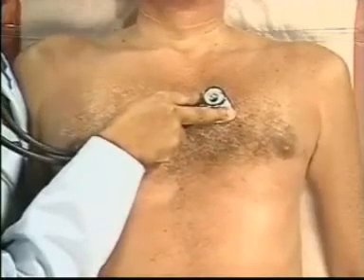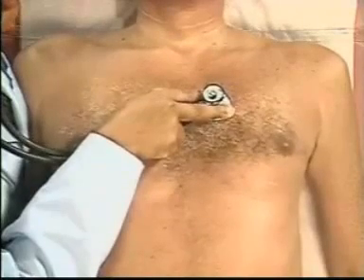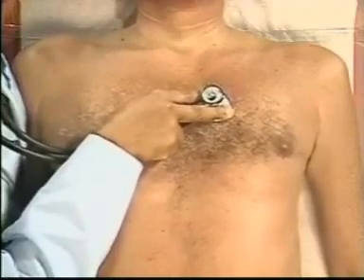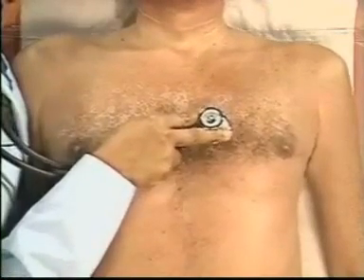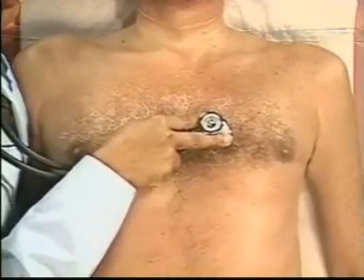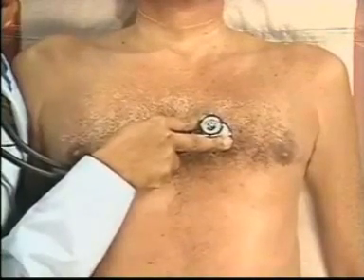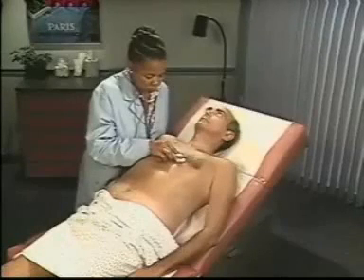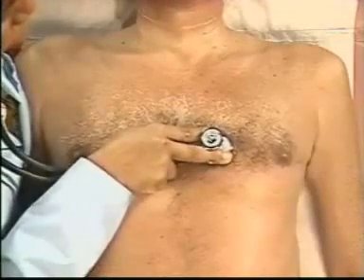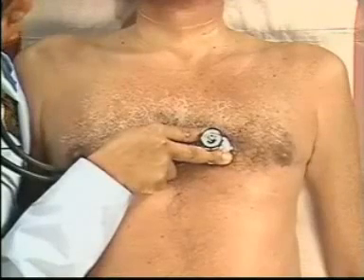Its first component, A2, is aortic. Its second component, P2, comes from pulmonic valve closure. In the left third interspace, both A2 and P2 may be heard again. You may breathe normal now. S2 usually diminishes in intensity as you proceed down the left sternal border. Meanwhile, S1 usually gets a little louder.